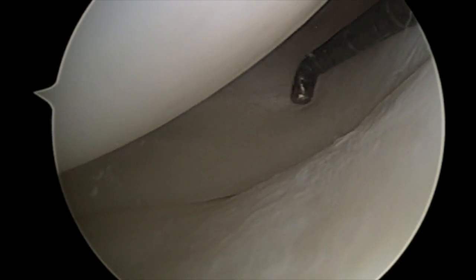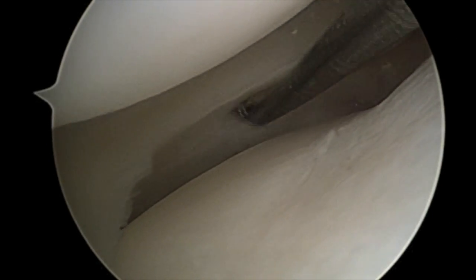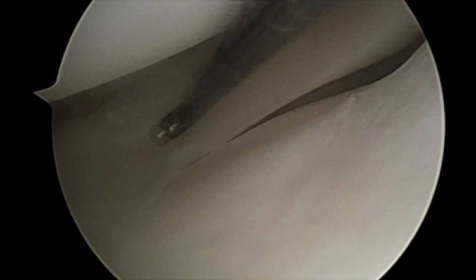Examination of the lateral compartment in this patient demonstrates what appears to be a prior lateral meniscus tear, which has healed in the interim while the patient has been undergoing preoperative physical therapy in preparation for her anterior cruciate ligament reconstruction.